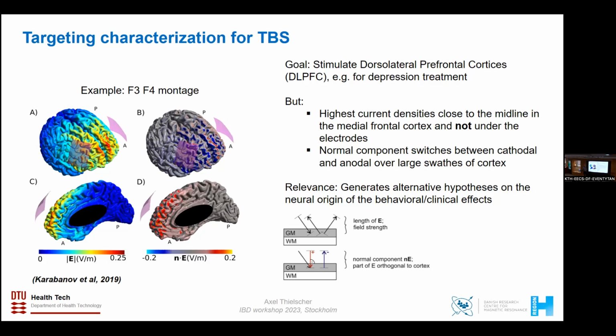So this just is a very straightforward tool to generate or test your hypothesis of whether the spatial targeting which you assume to have is really in place, or maybe whether you also hit other areas which are relevant for the task you try to test, or also the disease you want to treat at the same time, in addition to your original target position, right? So that's a very straightforward thing.